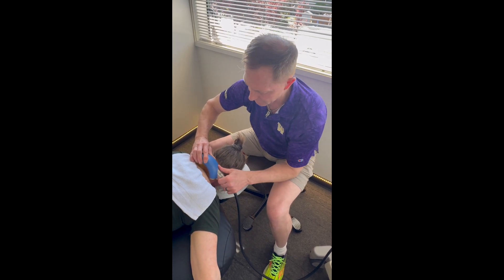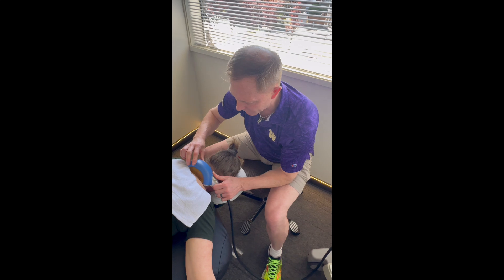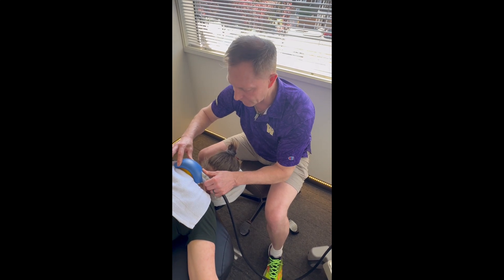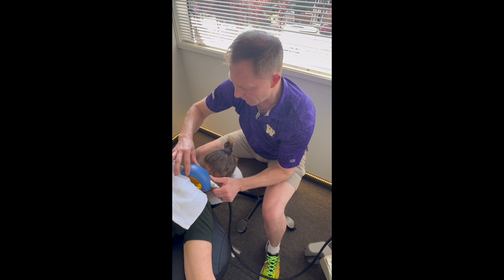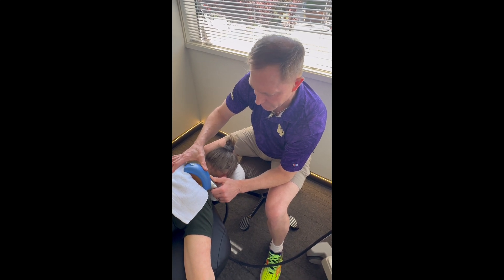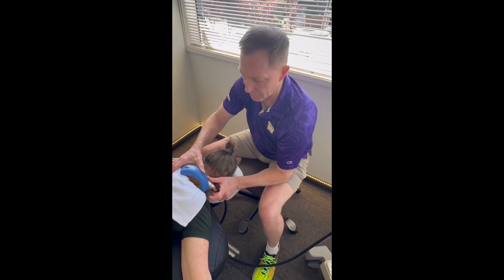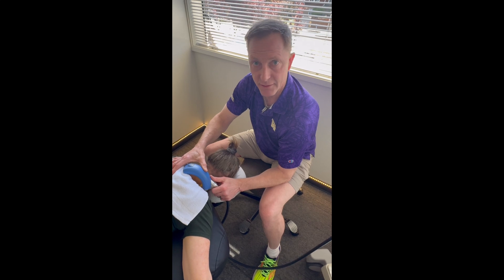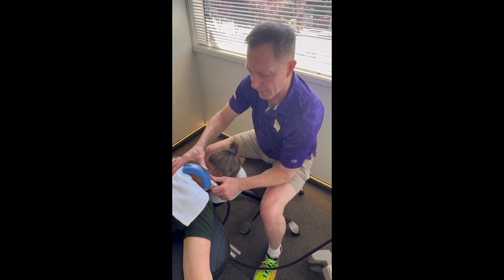Now I'm going to go hunting. I've gotten it up fairly high and she says she doesn't feel much, so let me push around. Coming over here — not a whole lot. She says that felt good. When you say it felt good, what are you feeling? Kind of like a deep massage — relief. So it relieves the tension in the bone. It's where the connective tissue is edematous that the energy absorbs best. She says that actually feels better. So sometimes people have spasms or injuries to muscles, tendons, ligaments, or entheses — and they'll say, oh yeah, that feels good there, keep doing that. And that's what we're looking for.